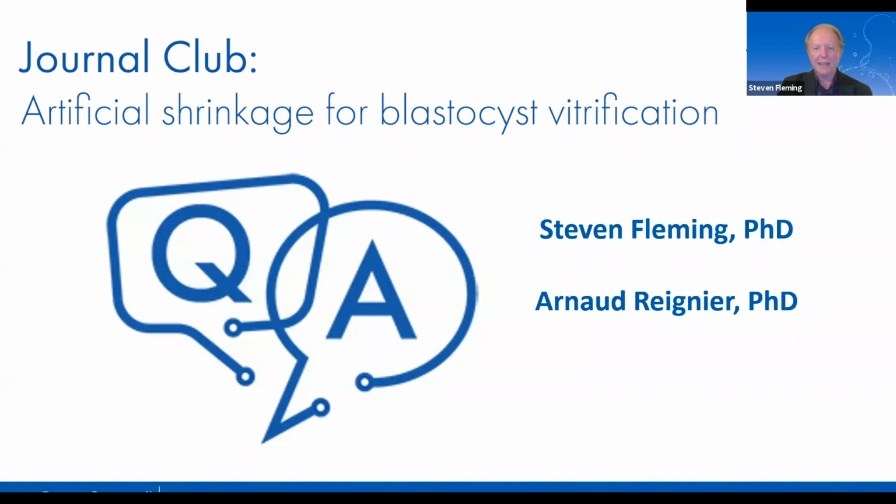So according to the time of transfer, it's sometimes not possible to see full re-expansion of the blastocyst on warming. So is the beginning of blastocyst re-expansion a sufficient sign of blastocyst survival? I'd have said viability, but the question is about survival. So when it is not fully re-expanded, you can say that it is alive, but you don't know if it's really going to continue its development.